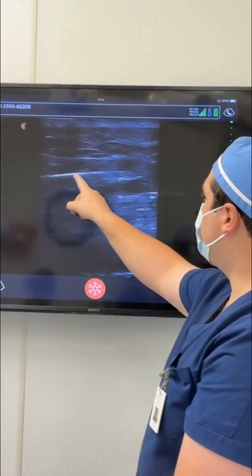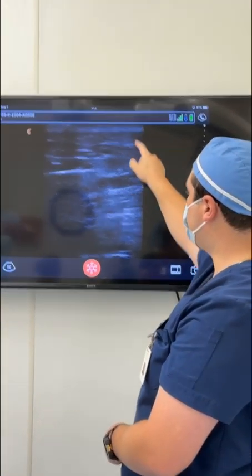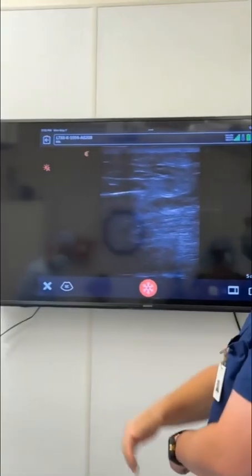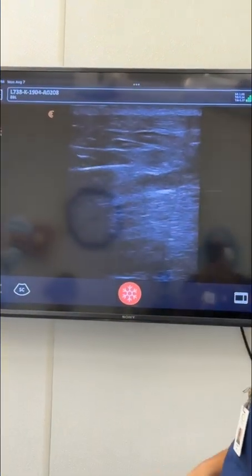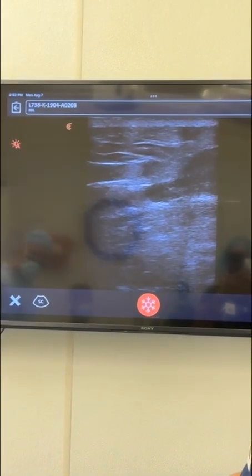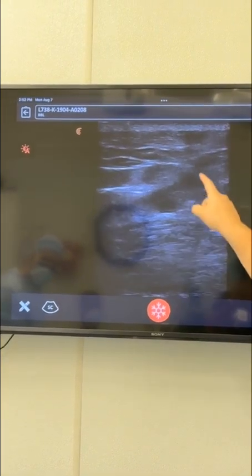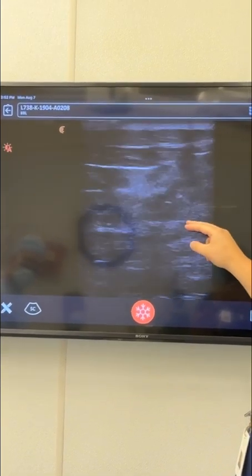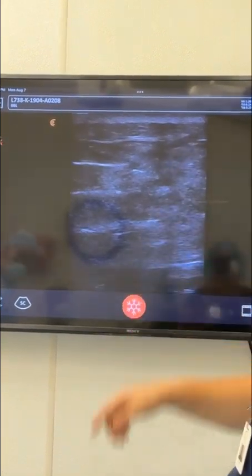We have Dr. Patino's instrument right here. This is the deep gluteal fascia right there, which means this is the space where the doctor can put the fat. This is the superficial gluteal fascia and that is the skin. Let me wiggle the cannula so you can see it. I'm going to withdraw it a little bit, and then you're going to see a bolus of the yellow fat. There we go — we can see the bolus coming into the space right here. The deep gluteal fascia is getting pushed down and the superficial gluteal fascia is getting pushed up as the fat enters this space.